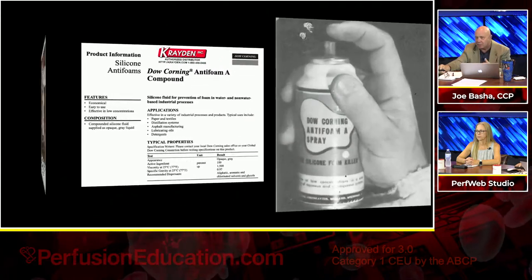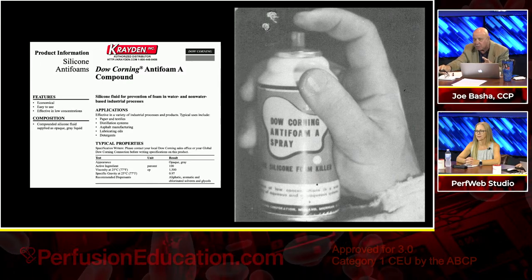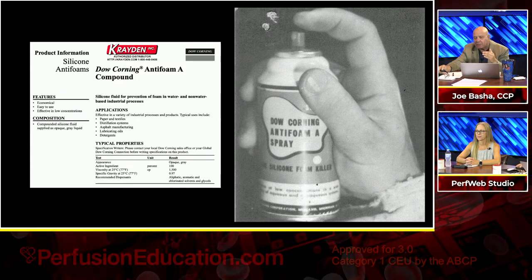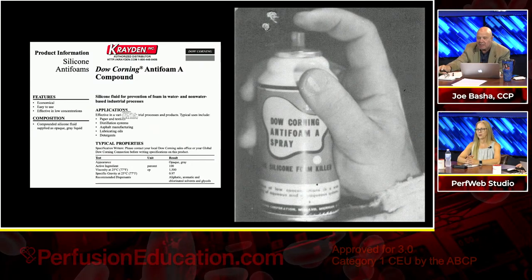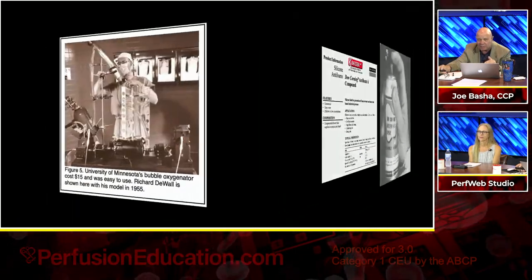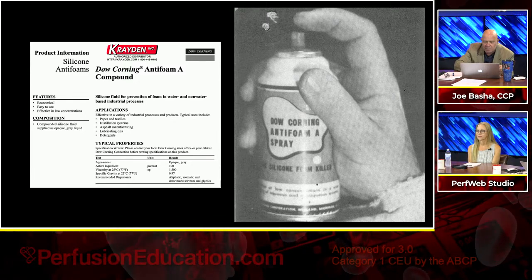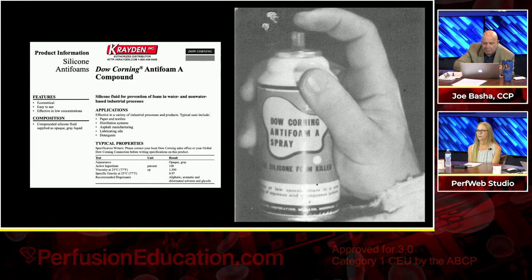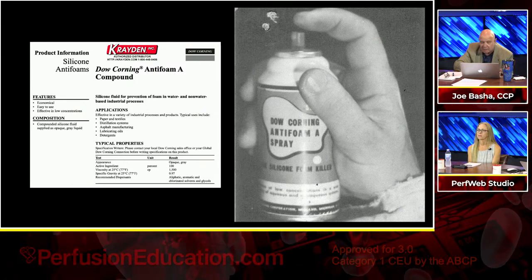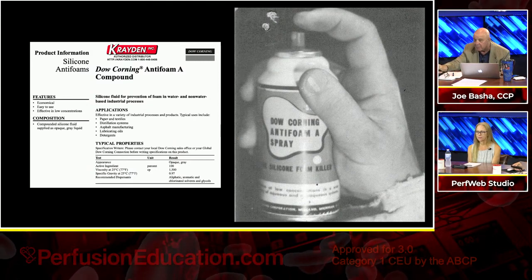So he used this substance. Now, how he knew about this substance is still not understood quite by me, but it's Dow Corning Antifoam A. There's the product literature, and that's an actual can of it. Let me just go back for a second if I could. Oops, I'm sorry, I went a little too far. Let me see here. Yeah. So this product is good for paper and textiles, distillation systems, asphalt manufacturing, lubricating oils, and detergents. It is a foam killer. That's what they call it.